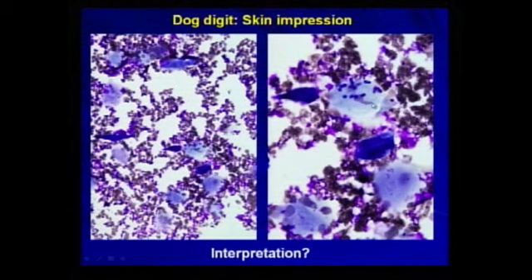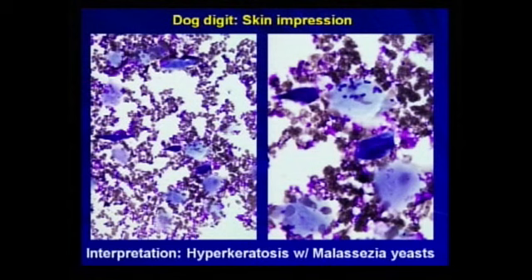They look like little footprints or bedroom slippers. This is Malassezia. And remember, sort of the cutoff is, if you see more than 10 in an area, it might be pathogenic, and we really don't know. This could be primary or secondary, but we do see Malassezia.